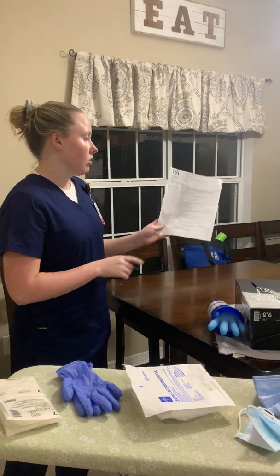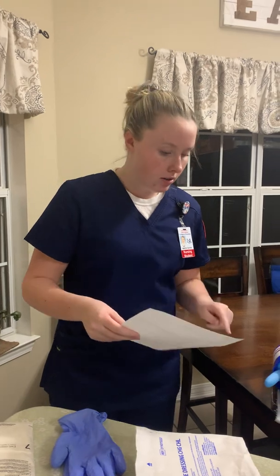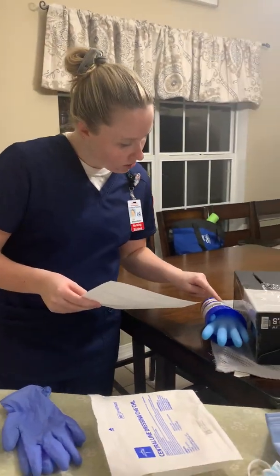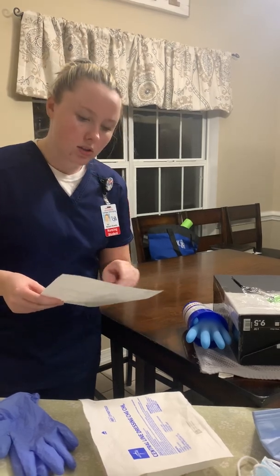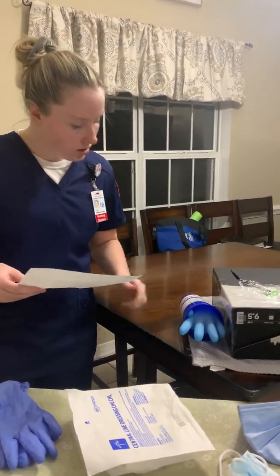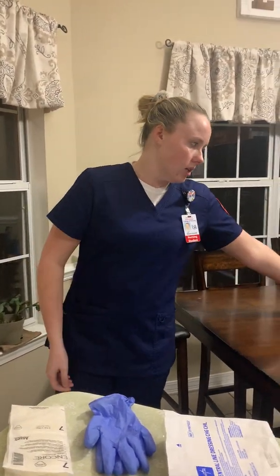Okay, so now I'm going to grab my order form. I'm going to look at the medical order, which is number 15, as well as follow the hospital policy. And then I'm going to do the two patient identifiers. I'm going to use the name and the date of birth. So Jaguar J. Jones, date of birth 08/25/1963. Allergies: penicillin. And I would also ask the patient if they had any other allergies that were not listed on the patient care order form. I no longer need this, so I can put it away.